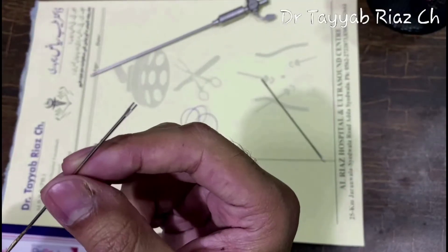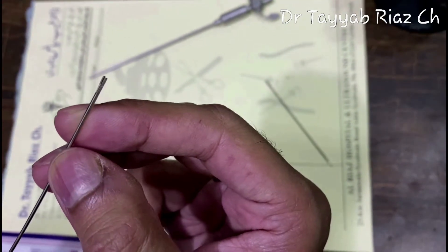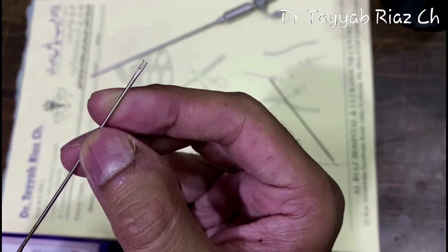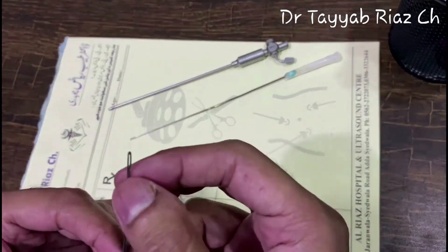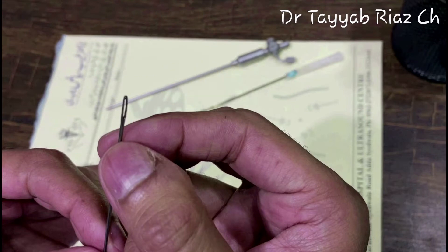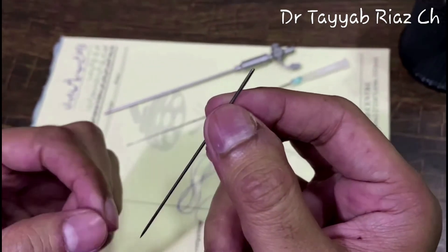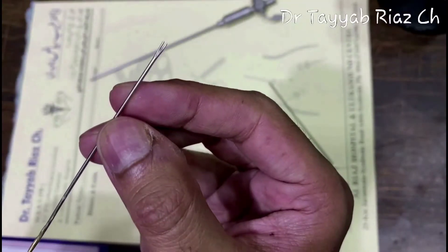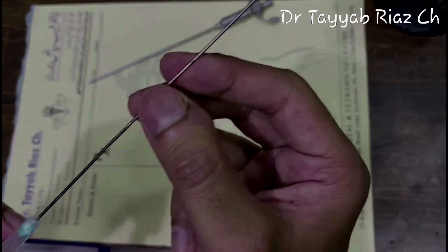I have invented this loop passer to perform various assisted two-port appendectomy. There is a groove at one end to accommodate the thread loop. I have used a hand quilting needle with an eye at one end, length of 6.5 centimeters, shaved off half the eye to make a groove, then joined two needles to make this full-length loop passer of 13 centimeters, accommodated in a 12-centimeter Veress needle.